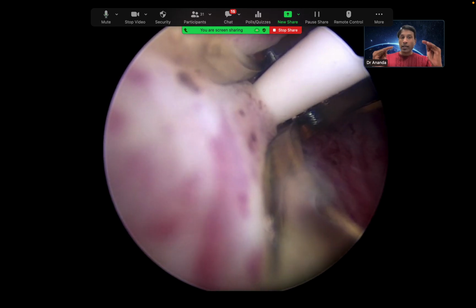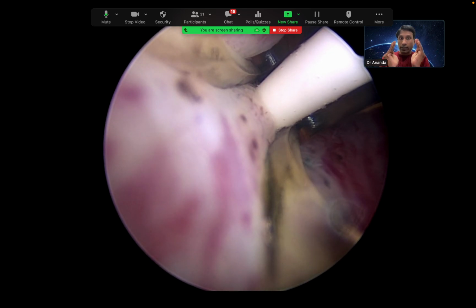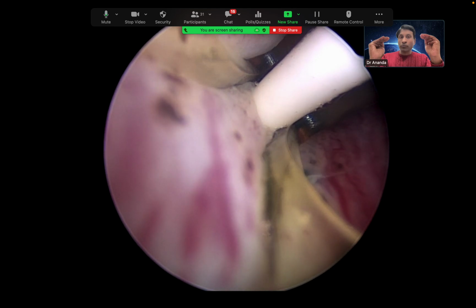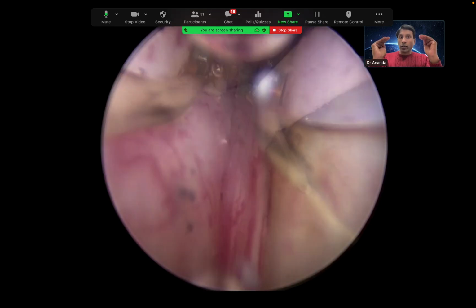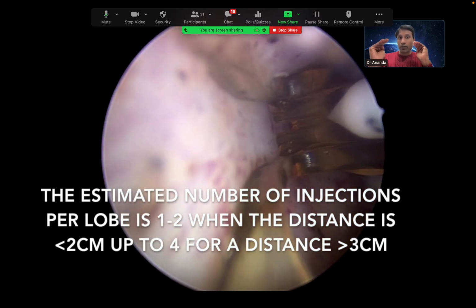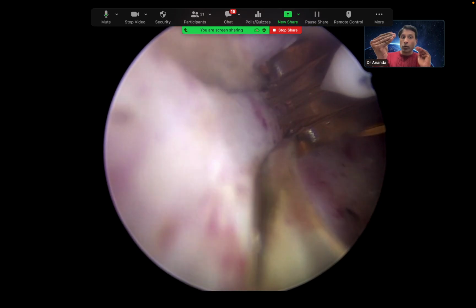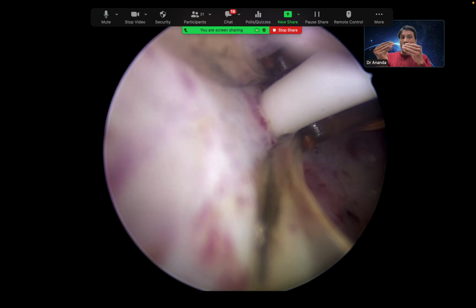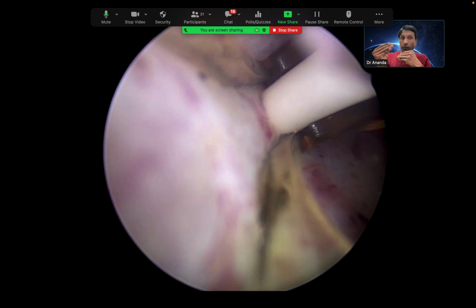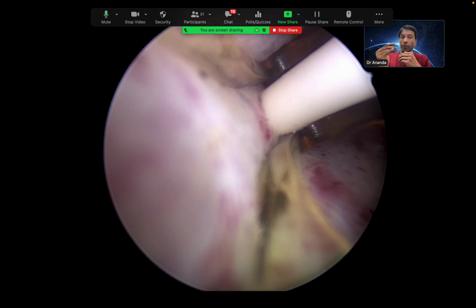Again, deployment should avoid going directly into the neurovascular bundle. It's better to stay just above it, and once you deploy, it automatically has a fixed time, and then the needle retracts after complete deployment. After that you can come behind, making sure you're not too far away from the verumontanum or affecting the sphincter, and you can do the second deployment.